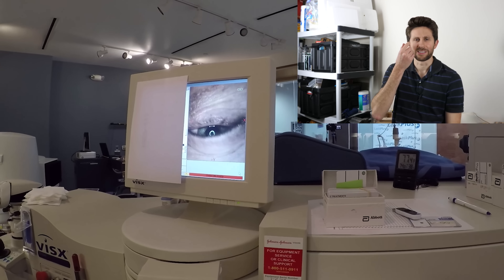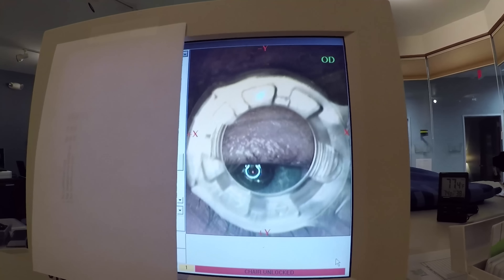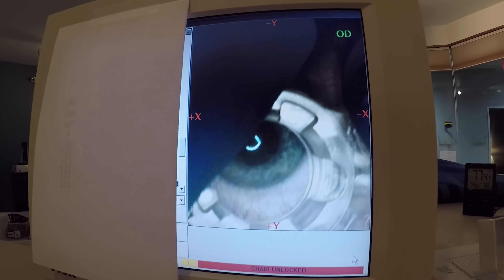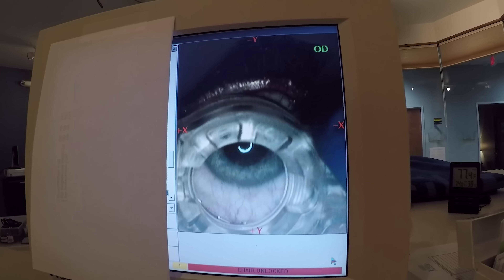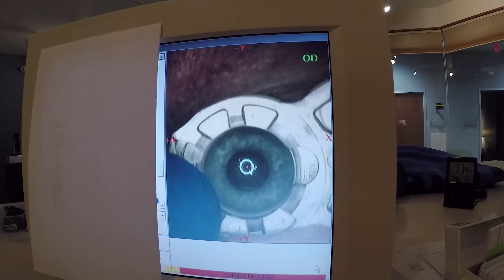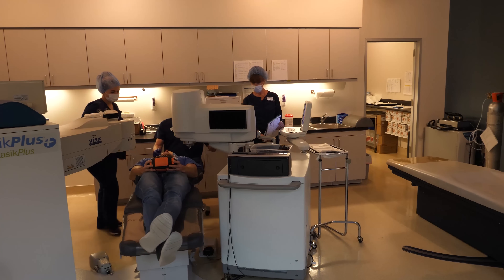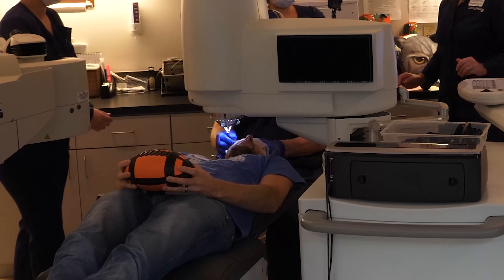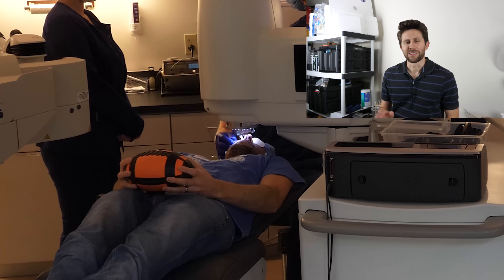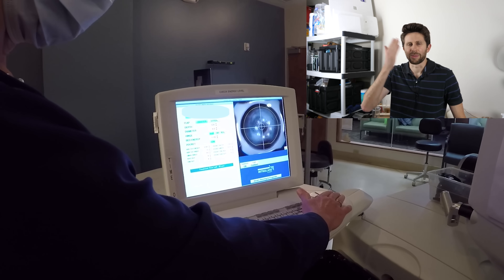Now as I'm laying down, they're putting those suction cups on my eye. Then they swing me over to the other chair — that pressure is going to last about 30 seconds. Then they put me under the machine and dock it against my eye. This was the most uncomfortable part, because the pressure on your eye actually makes your vision kind of black out.